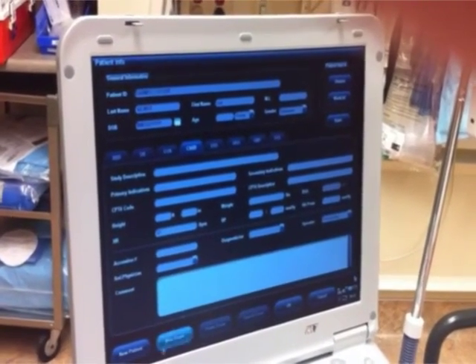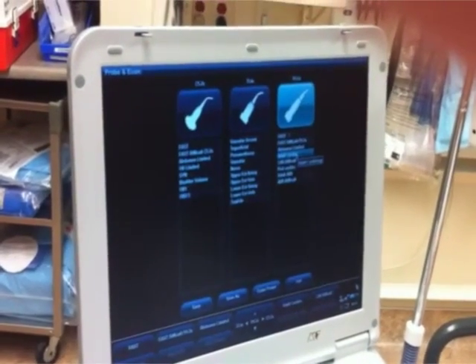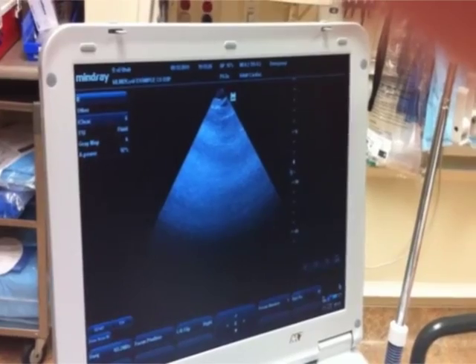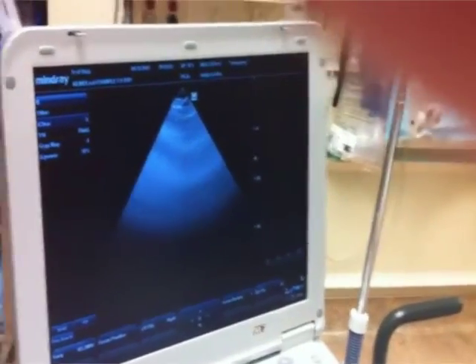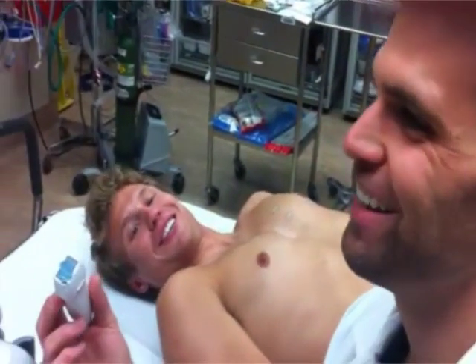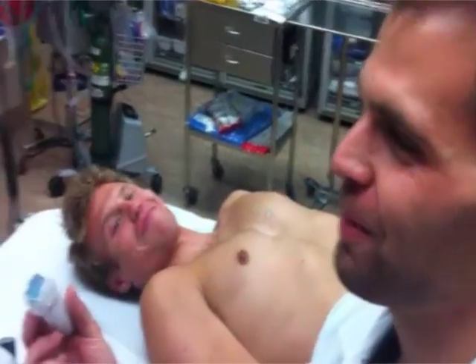And then once I've got that all in there, I'm just going to go ahead and start with my exam here. So we're going to do an adult cardiac mode, and that tells the machine that we're going to do some measurements using the cardiac mode. If you set it for endocavitary, I'm leaving. So we'll do the endocavitary example in a minute.